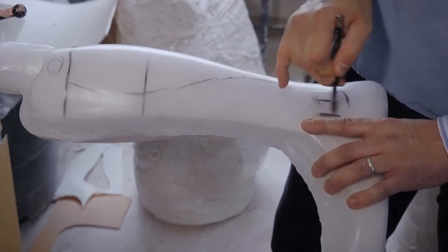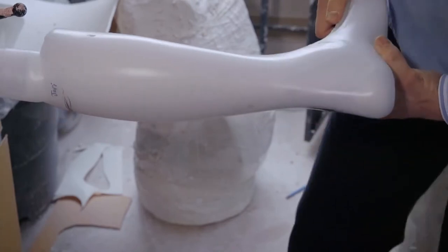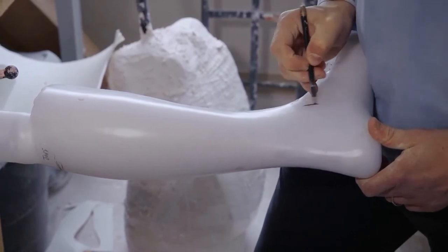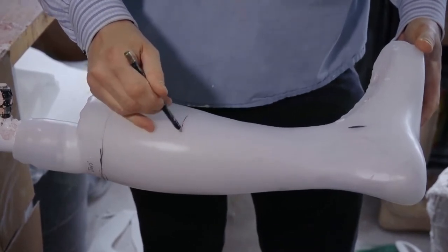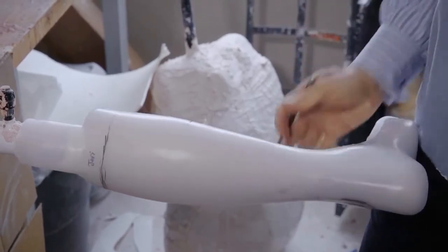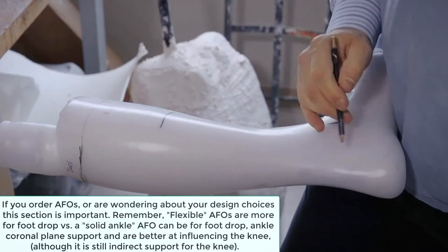So this would be the solid AFO. This would be the trim line for the flexible. And we'll turn this around so you can get an idea of what the solid would look like. So right here is in front of the ankle bone. Okay, we're going to continue over our heights. Okay, so here's a solid AFO. So this person probably has a foot drop. And we also have to think about indirectly supporting the knee. So we need more control at the ankle.